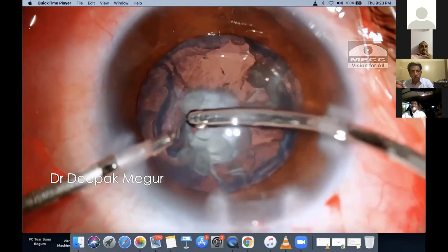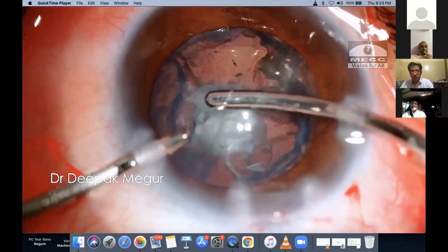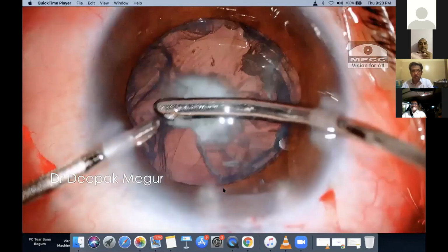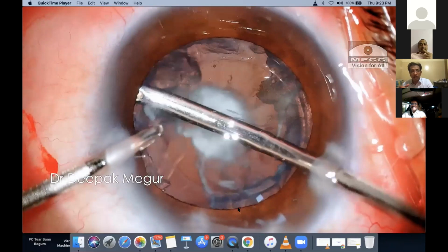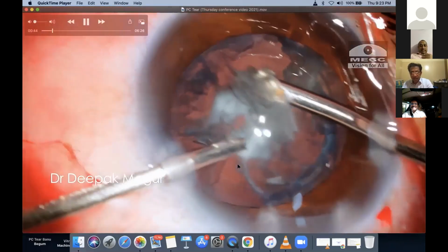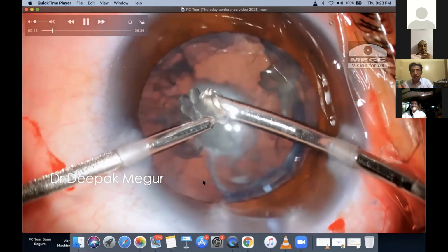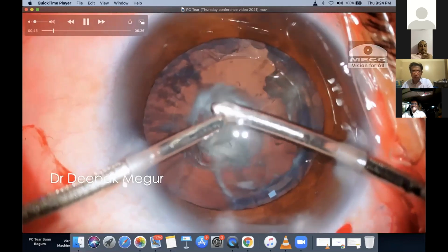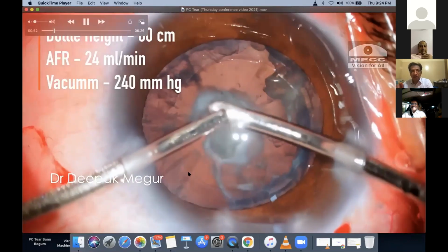The whole trick is you need to be as gentle as possible in these cases, because I'm assuming that there is a posterior capsular tear already, although it's not very clear here. I can see some line here, this line, and I'm suspecting that there is an underlying posterior capsular tear here. So my goal at this stage is to prevent any rupture of the anterior hyaloid face.